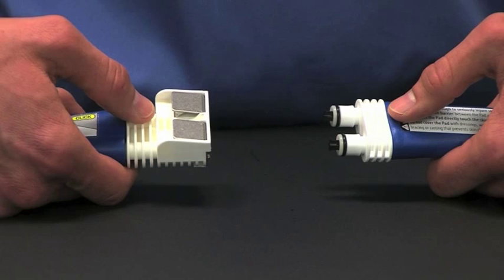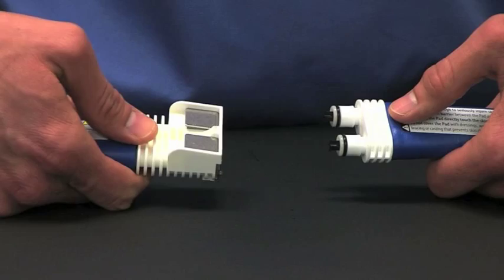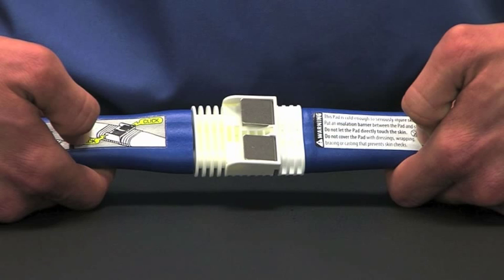The next step is very important. Before connecting the pad to the unit, push down on the two metal tabs. You'll hear each click when you push them down. Firmly push the unit and the pad together. You will see the two metal tabs pop back up and hear the clicks. If you force the unit and the pad together without depressing the metal tabs first, you may damage the connector.